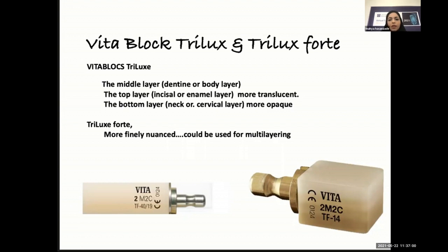They allow the characteristic color gradient present in the natural dentition to be replicated, both in terms of translucency and intensity, so facilitating the integration of the restoration into the residual tooth substrate or residual dentition. So it's indicated for highly aesthetic reconstruction in the visible area, I mean anterior crowns or veneers.